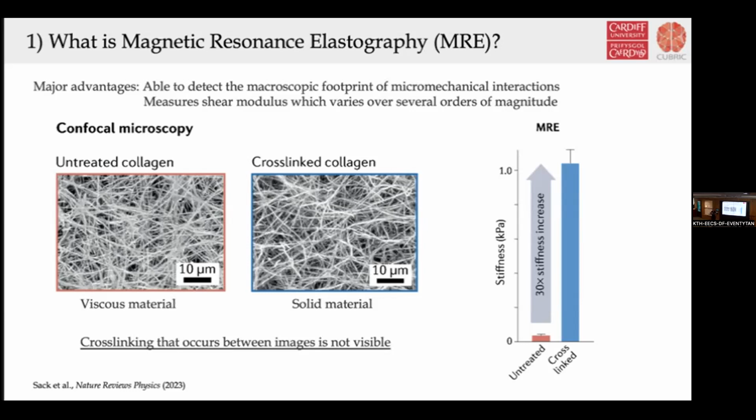So the quantification of the viscoelastic behavior of soft tissues provides information on the mechanical integrity of multi-scale tissue structures that will vary significantly with health and disease.